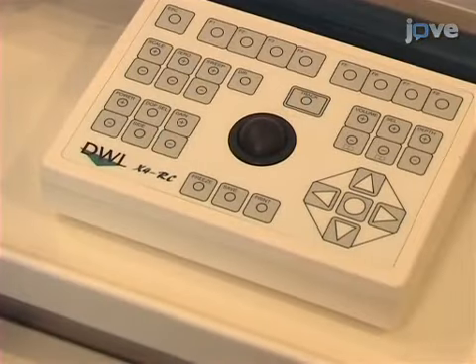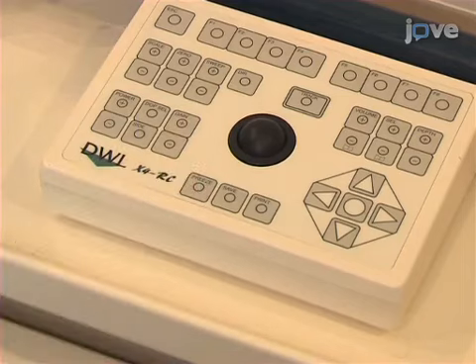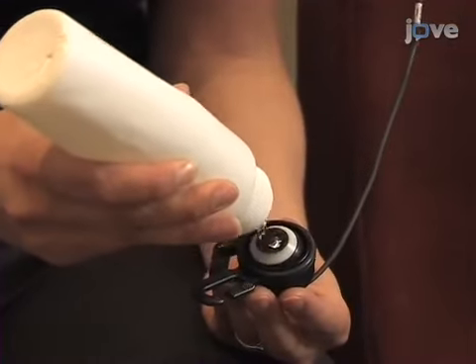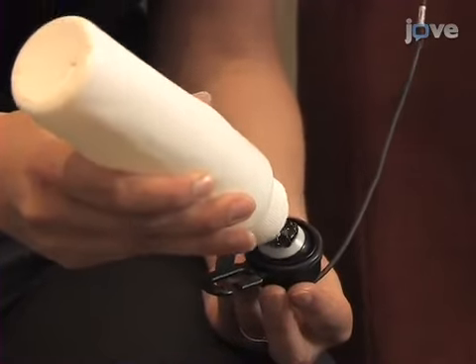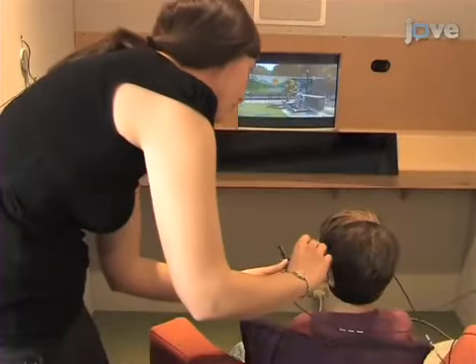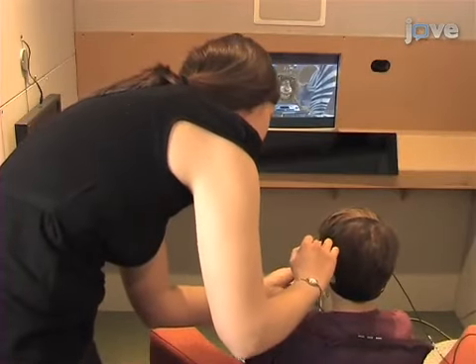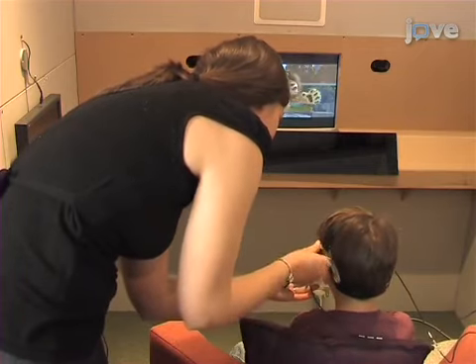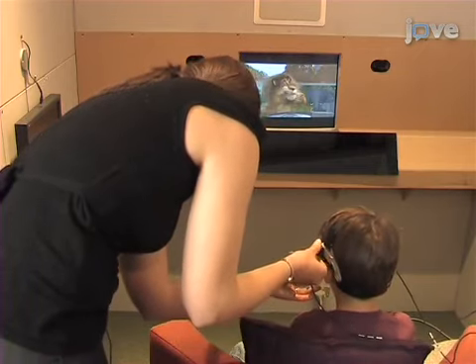Switch the multi-dop system to pause while preparing the ultrasound probes. Cover each probe with a generous amount of ultrasound gel to maintain the best contact possible between the probe and the skin. While the child watches a DVD, position the gel-covered probes at the temporal window of the skull on each side of the head just forward of the ear, where the bone is thinnest.